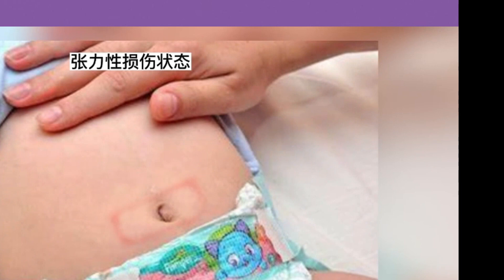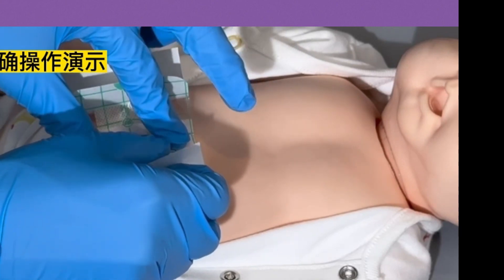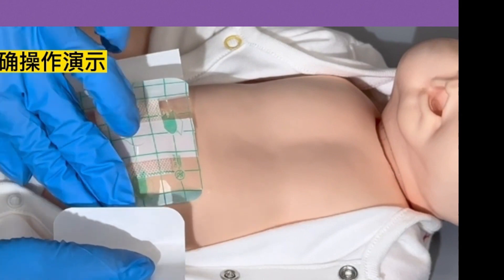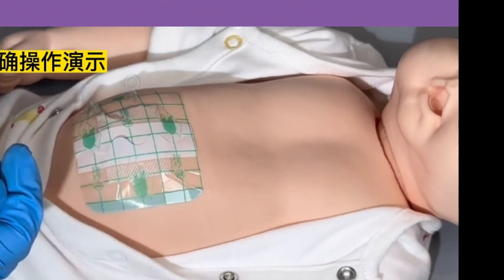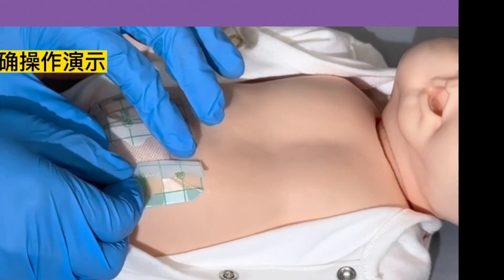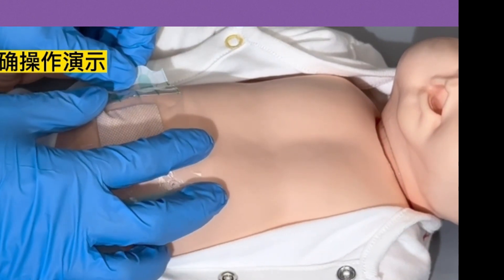The second point: when many parents apply the umbilical tape, they habitually stick one side first, then press the other side down. At this time, the baby's skin is stretched and tight, causing a tension injury that results in redness in the outer ring. This is different from a glue allergy — with a glue allergy, only the parts of the skin in contact with the glue become red. The correct method is tension-free pasting: apply from the middle outward to all sides for a better fit.